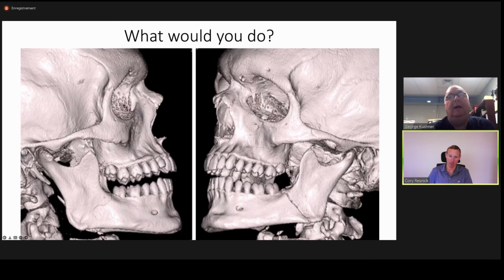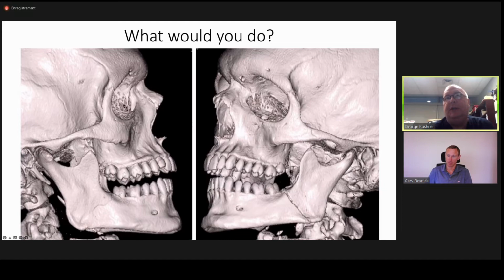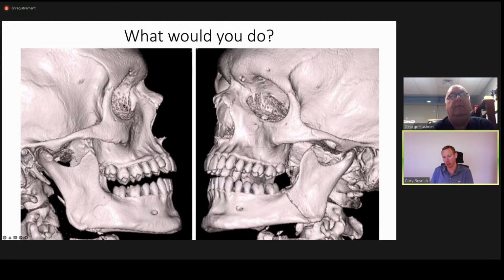And I'm going to jump in on this one. I've seen everything from a tooth that required absolutely no treatment, it was just an incidental observation, to another one that required root canal. And we've actually seen some teeth shatter, which required extraction. So you can see the whole gamut depending on how much that tooth is damaged. Yeah. I will say, as you get more adept with IMF screws, there is a tactile difference between a tooth root and normal bone. So you may still run into a tooth, but hopefully you can avoid creating a really bad dental problem if you feel that tooth root and reposition before you keep going.